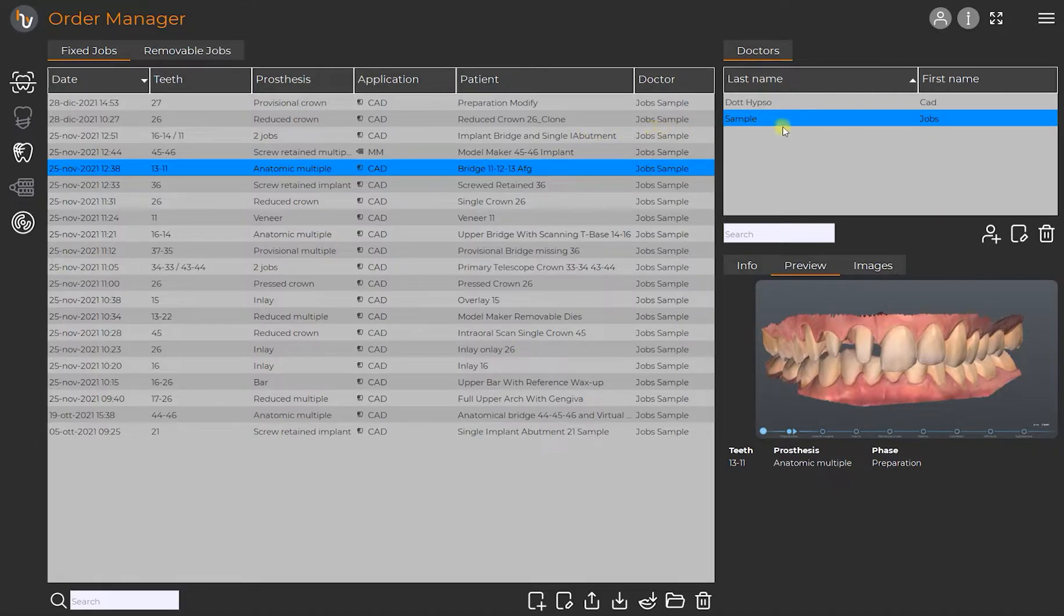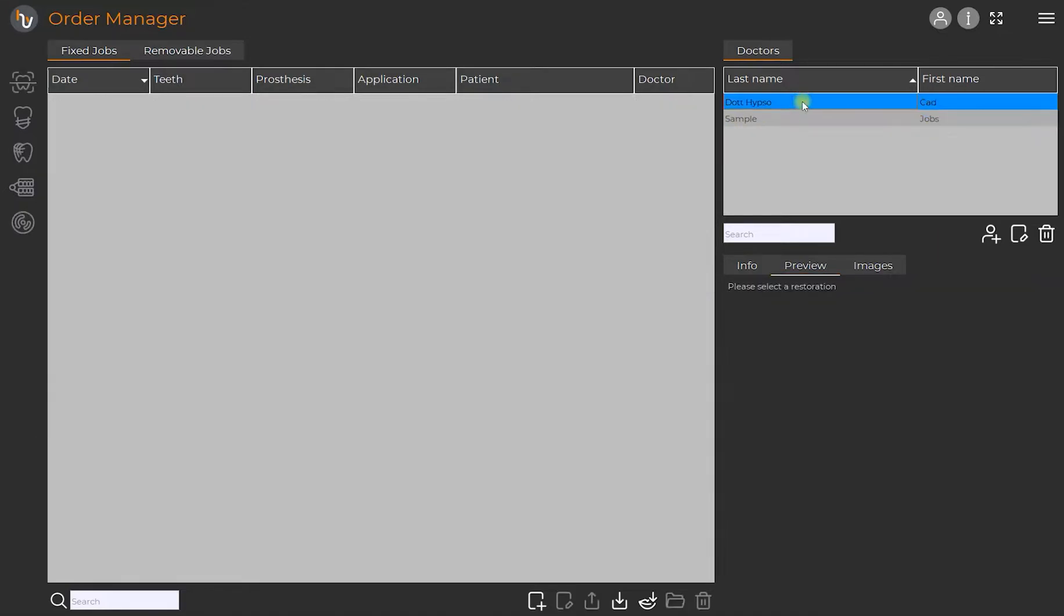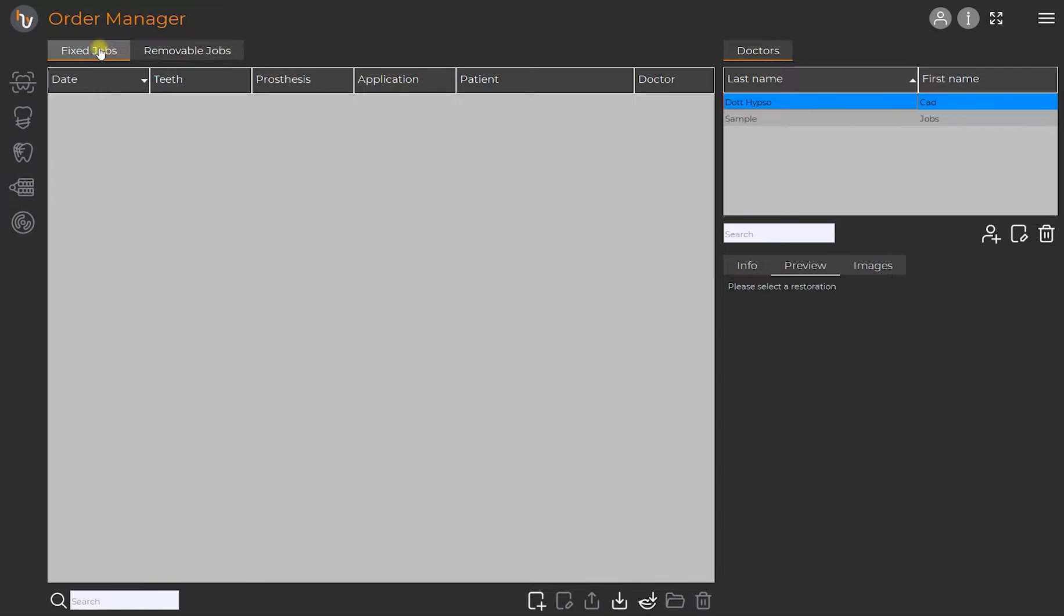In order to create a new restoration on HIPSOCAD, firstly you must choose the name of the doctor and the kind of job you are going to carry out between the options fixed prosthesis and removable prosthesis. Once you do this, you can click on new job.